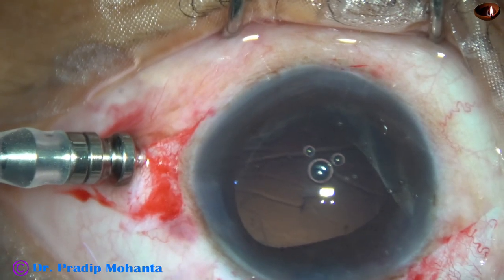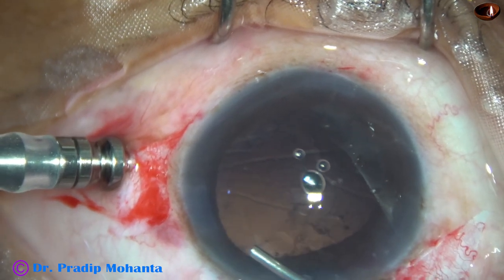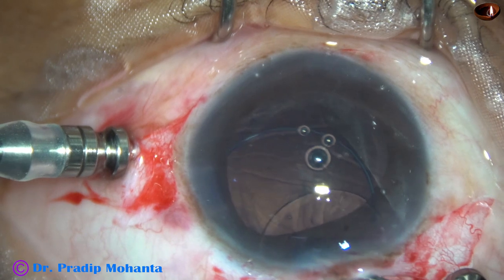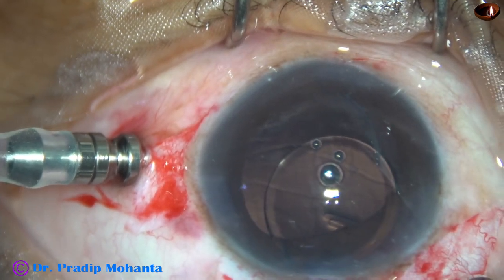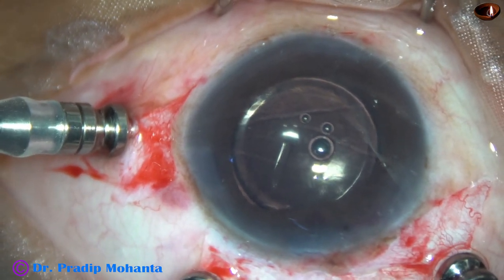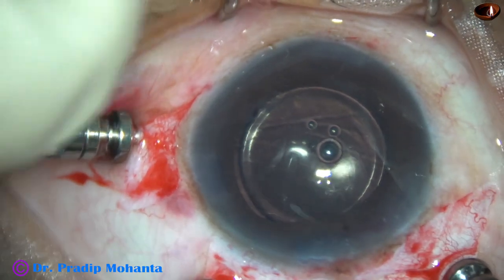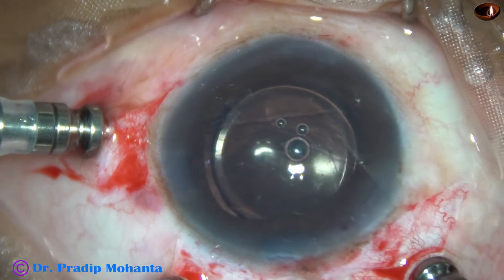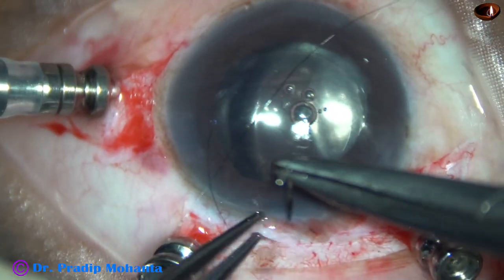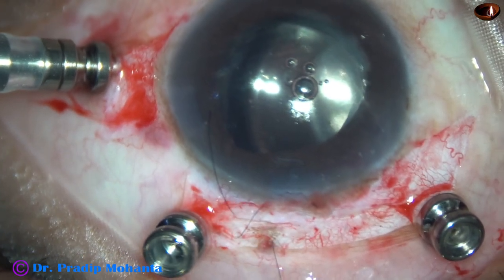There was some more cortex that had dropped, and that was nicely removed by the cutter. Now I used Viscoelastic between the anterior capsular rim and the iris to create some space, and then implanted a foldable multipiece intraocular lens. When we have a sclerocorneal tunnel it is very easy to implant the lens — it easily goes in the sulcus. If we use an injector we need a lot of skill and judgment to place the lens in the sulcus, but with a sclerocorneal tunnel you just have to go straight and place it over the anterior capsular rim — both the leading haptic and the trailing haptic.